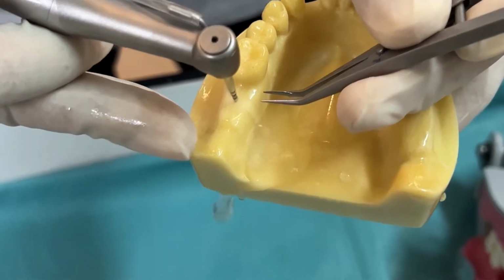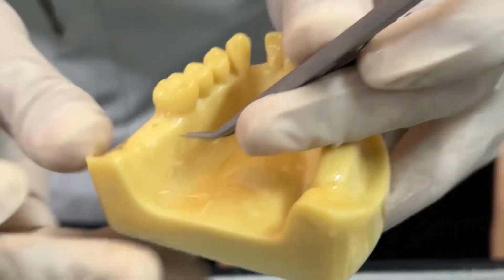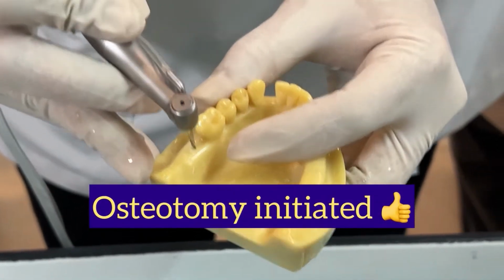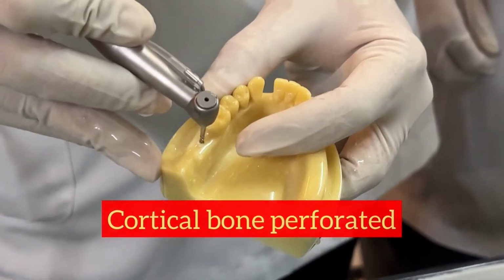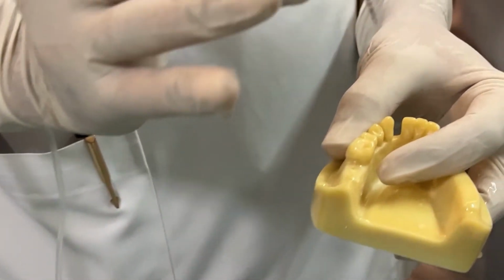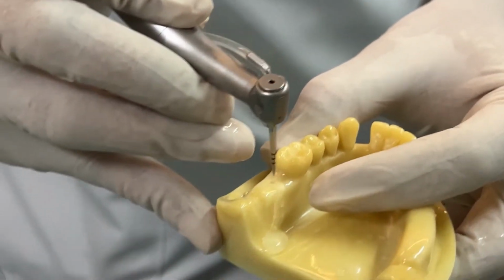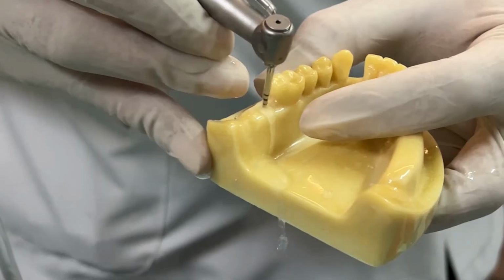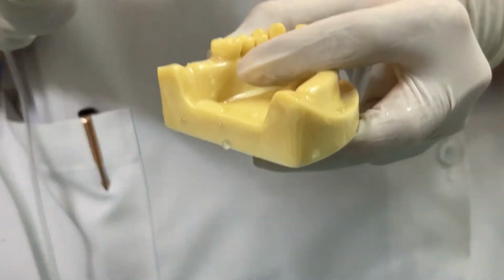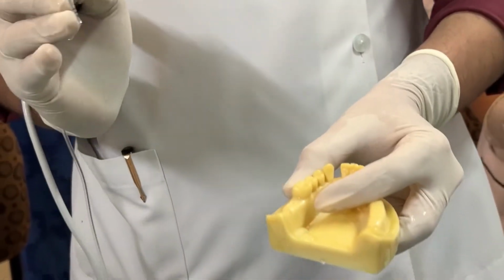So again the same procedure is demonstrated, in which we have initiated an osteotomy in which the cortical bone has been perforated by the lance drill. Now in this the rule is simple. Please ensure that the drill is rotating before it is entering, and it is rotating till the time it is coming out. If you stop in between, what will happen is the drill might get stuck in the osteotomy site.